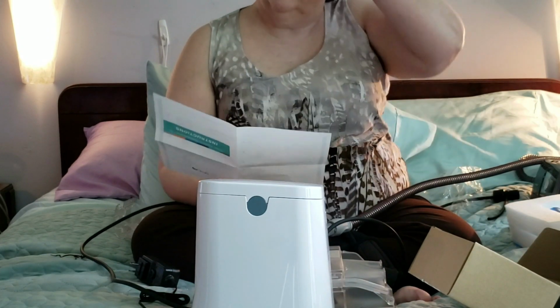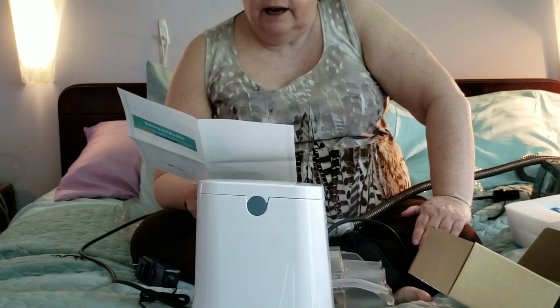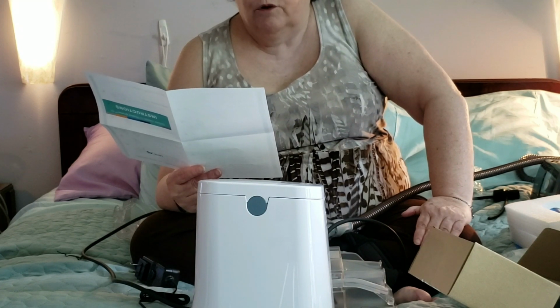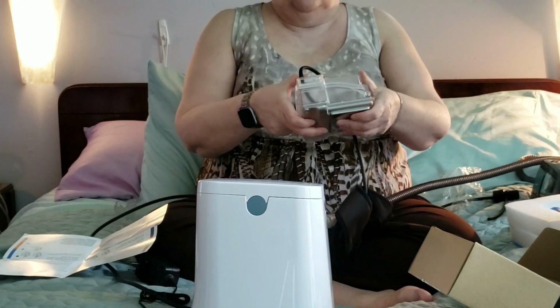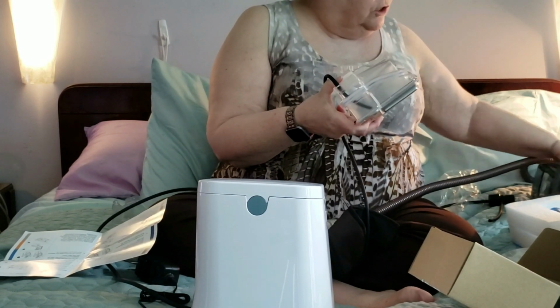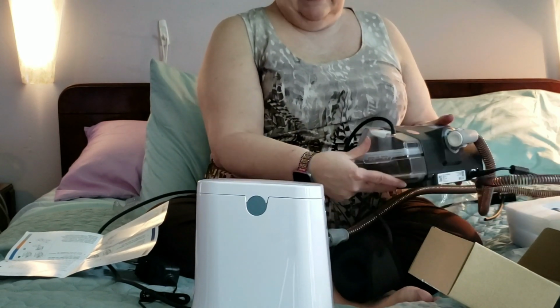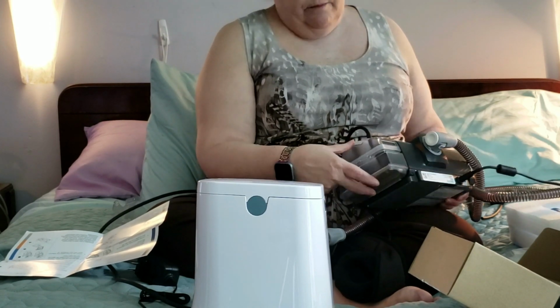So let's see if we have more instructions. Insert lid if needed, fill the reservoir. To add water to your humidifier reservoir, please remove the SoClean tube from the adapter lid and remove the reservoir. Yeah, you do have to, because this fits fully into the CPAP machine, or this is an auto-titrating machine, kind of APAP. Because it fits in like that, you obviously can't open this lid. So you do have to take it out. And I'm okay with that.